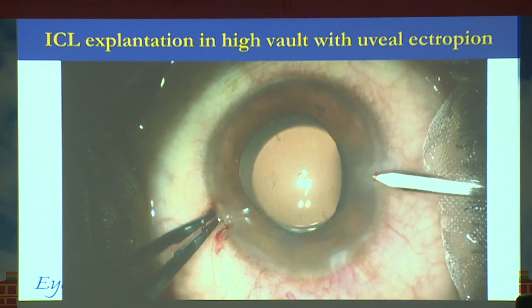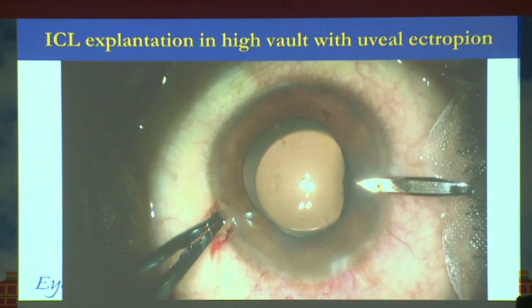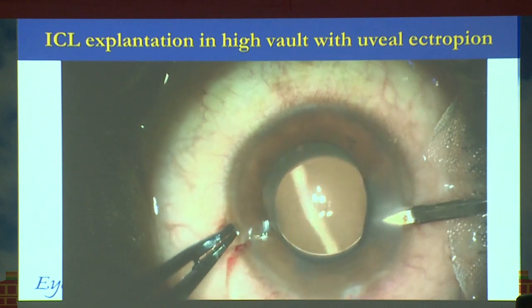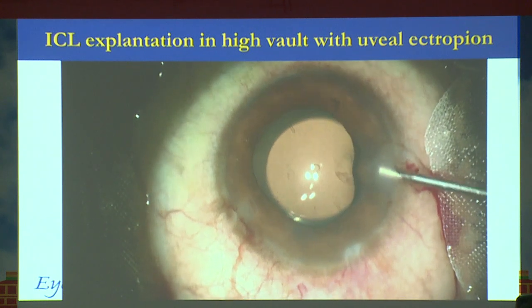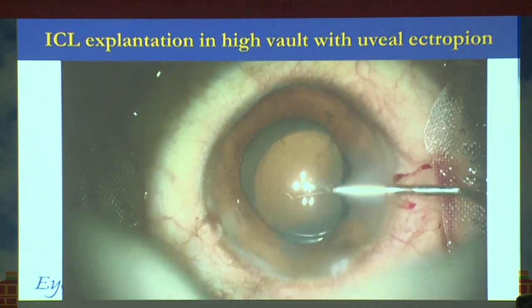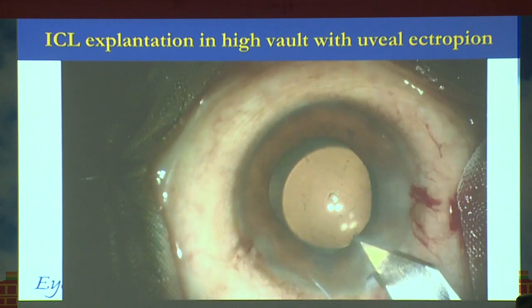See, entering from the other side. I'm almost rubbing on the uveal tissue, pushing the uveal tissue, trying to find a way in. But, well, I have found a way in. That was one. Trying to increase that space by visco. And then the main incision.